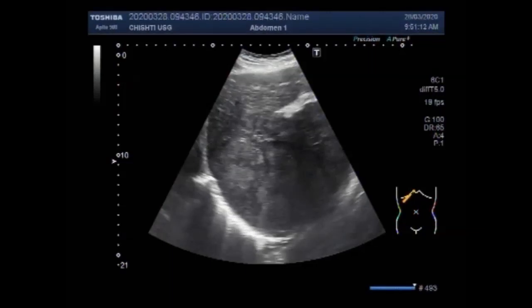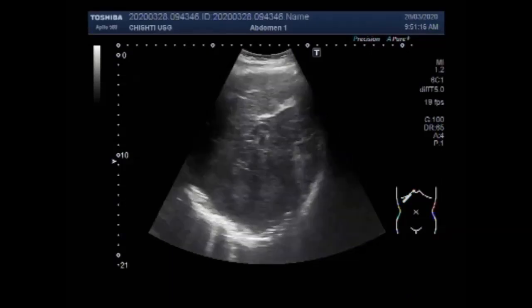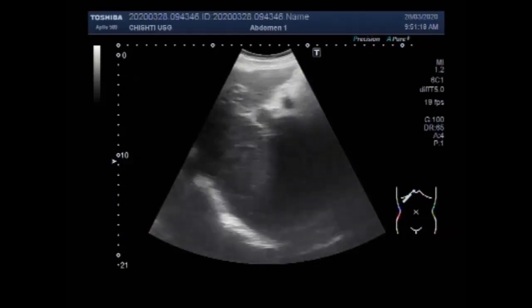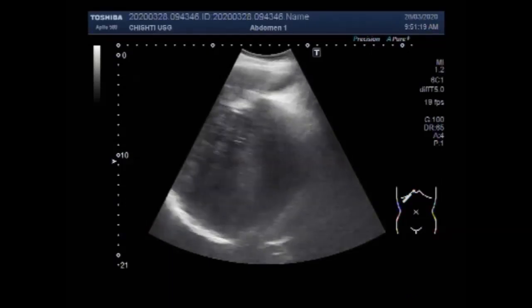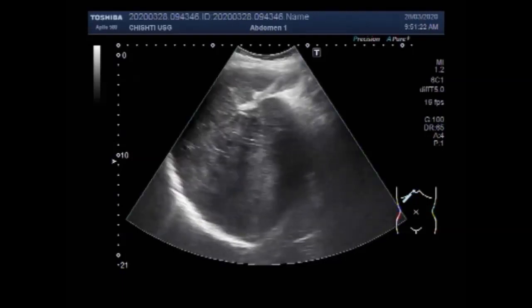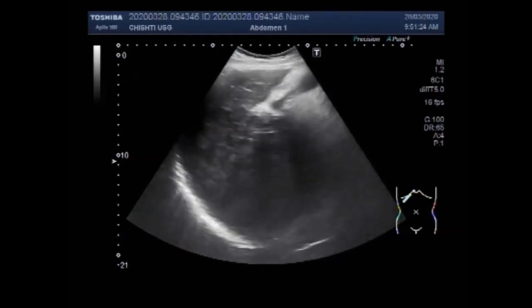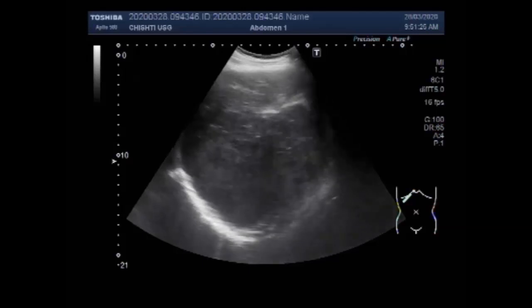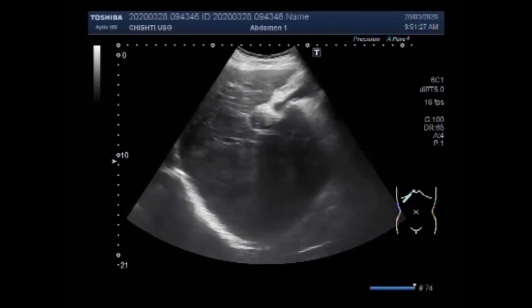Dear viewers, I hope you are all fine. This ultrasound video shows multiple findings in the patient, including an enlarged hepatic mass, splenomegaly, minimal ascites, and an enlarged prostate.